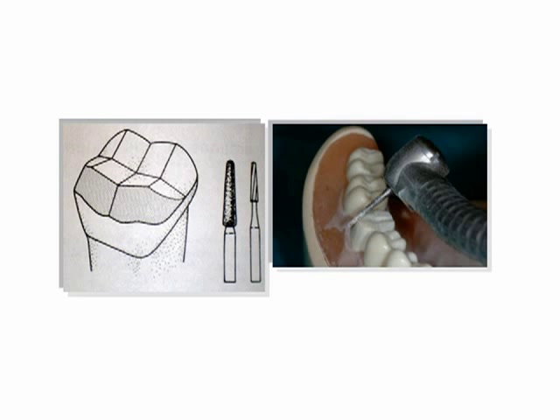Step 2. Place the functional cusp bevel. It is parallel to the slope of the opposing cusp. This will be at approximately 45 degrees to the long axis of the tooth. The occluso-axial line angle of the non-functional cusp should also be beveled or rounded. This is referred to as the non-functional cusp bevel. Reduction can be verified by closing into red wax, and measuring the reduction with a caliper. Perform this also with lateral mandibular movements.